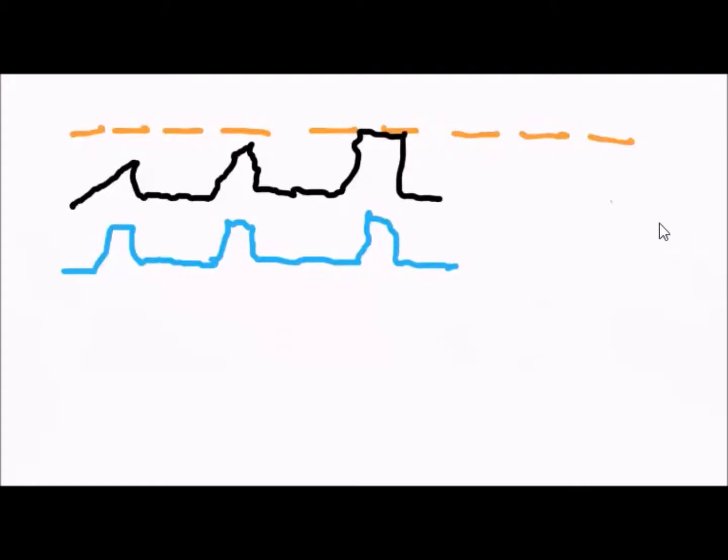However, this is pressure limitation, and this is only one component of pressure control. If the patient's drive changes and they become more vigorous, to get the target tidal volume you have set it takes a lot less pressure, and what you'll see is actually pressure scooping. The pressure waveform never meets this pressure limit, so it doesn't change into a pressure controlled breath. So my flow rate is not variable at all. It just stays the same. It's still going to be a constant flow.